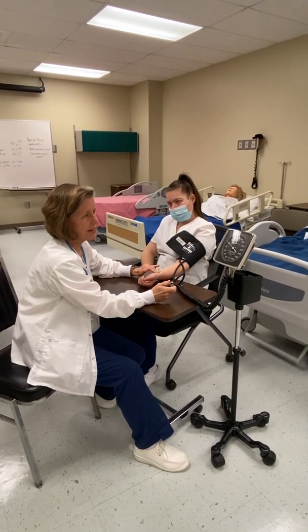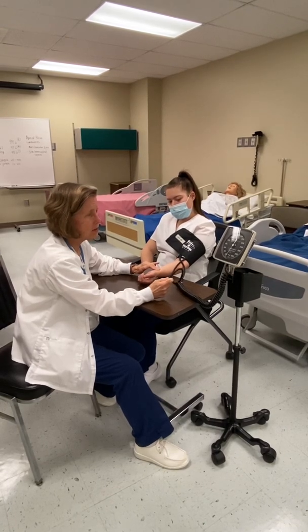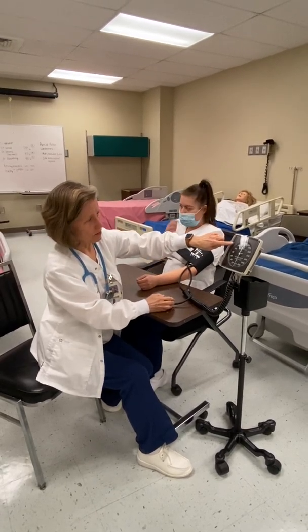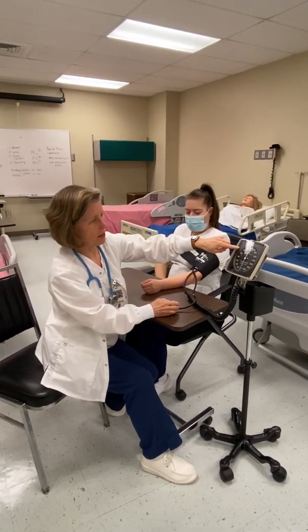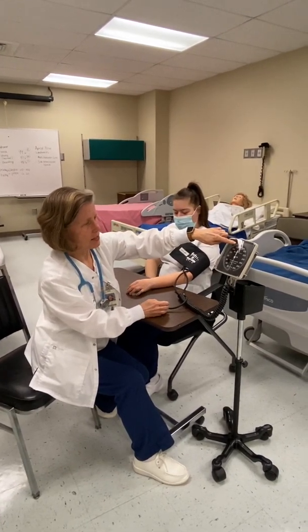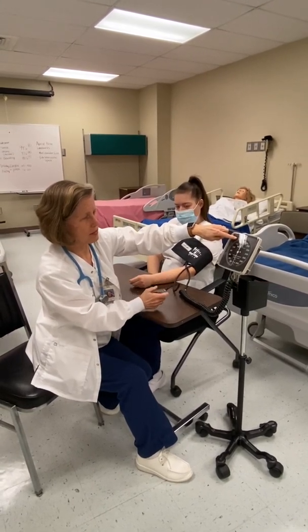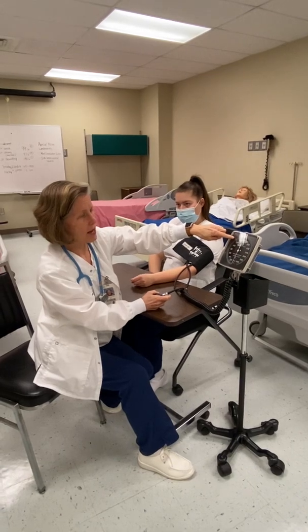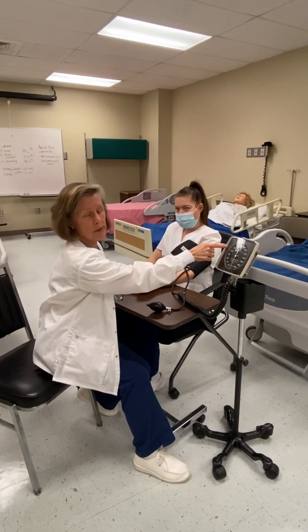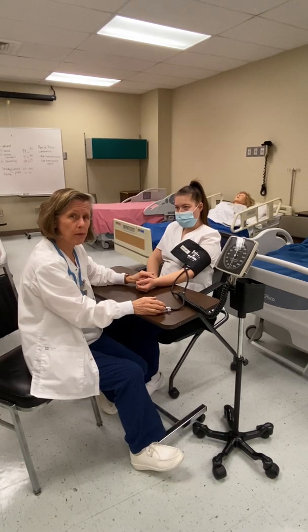Right there, at about 110, I actually felt that pulse return. So I'll go ahead and let the rest of the air out. To recap: I pumped up until the pulse disappeared at about 120, then pumped 30 above that to 150. As the air slowly came out after loosening the screw valve just a tiny bit, I palpated and waited for the pulse to return — hers returned at about 110. That means 110 is the palpated systolic blood pressure.